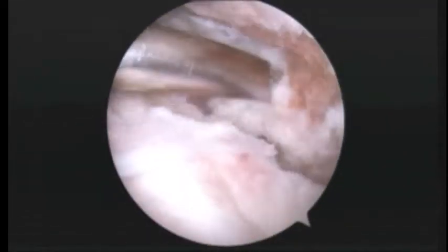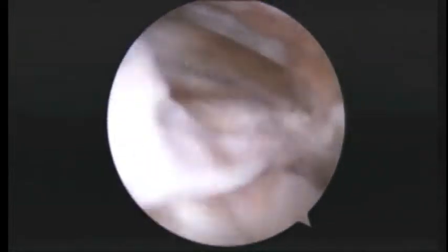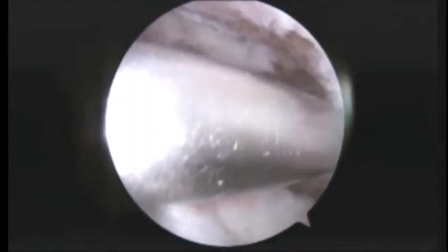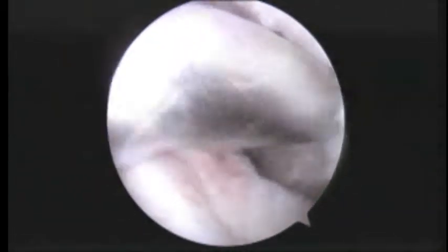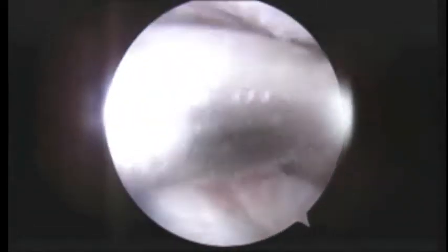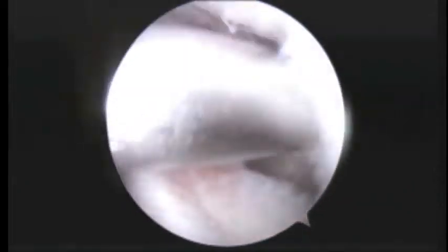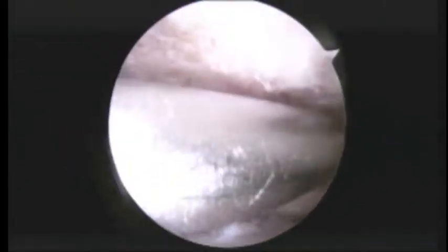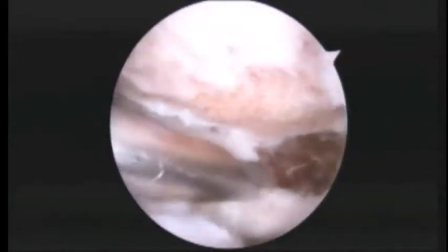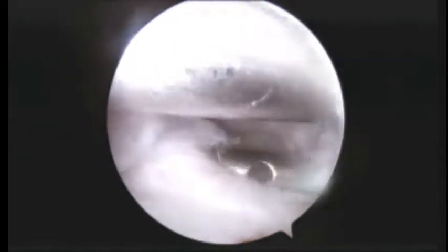And so we're going to go ahead and start the burr and just remove this little lip of bone that has the potential to dig into the rotator cuff and even affect the repair. So by removing this, we're going to make a lot more space for the flow. Okay, so there's the bone now. And we've got that where it's nice and smooth and flat. And hopefully shouldn't present a problem to the rotator cuff once we fix the rotator cuff.